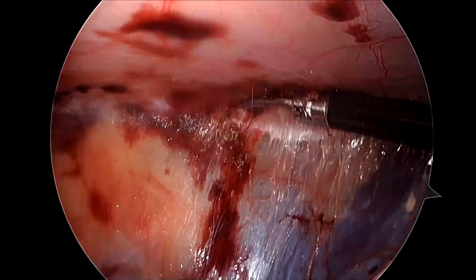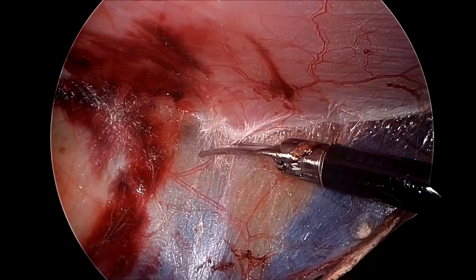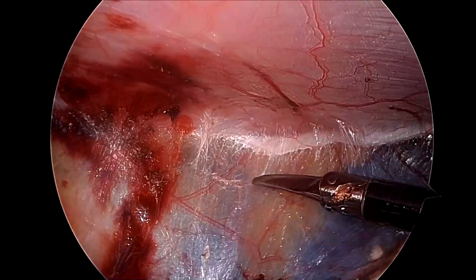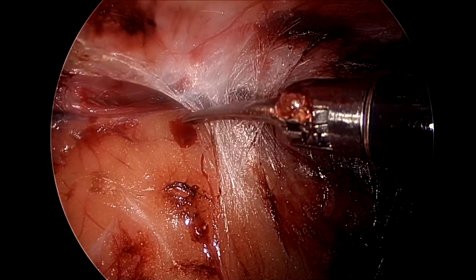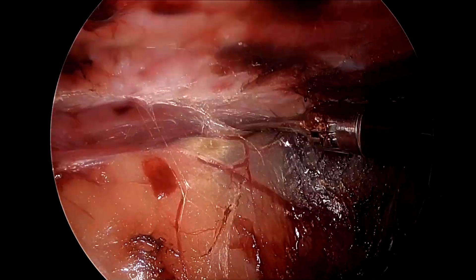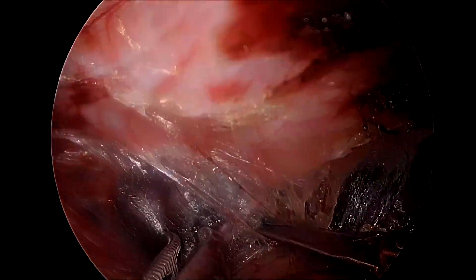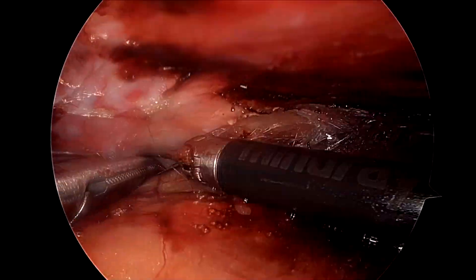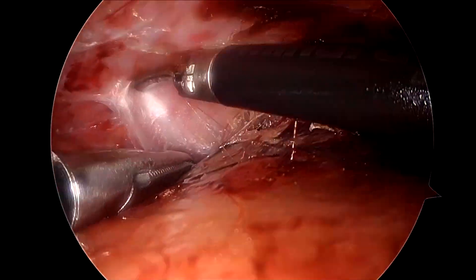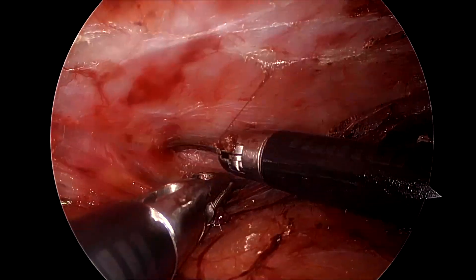Be very slow and gentle with the dissection, using just the optimum amount of blunt force cranially, pushing the peritoneum away and dividing using scissors wherever required. This is again a very challenging place where you need to be very slow and gentle because the peritoneum is very thin, so use very slow and very gentle movements with soft hands so that we don't cause any inadvertent buttonholes.